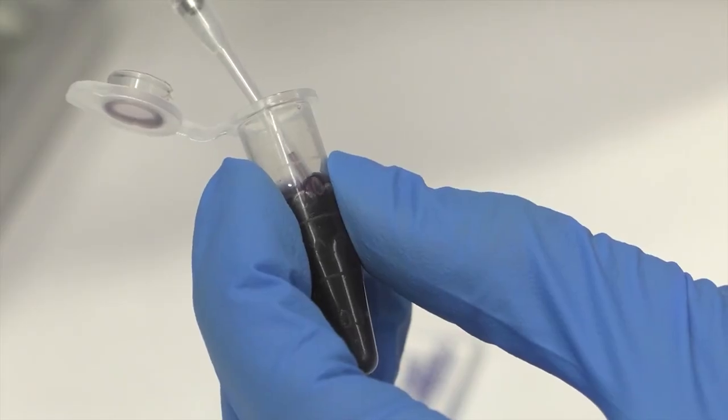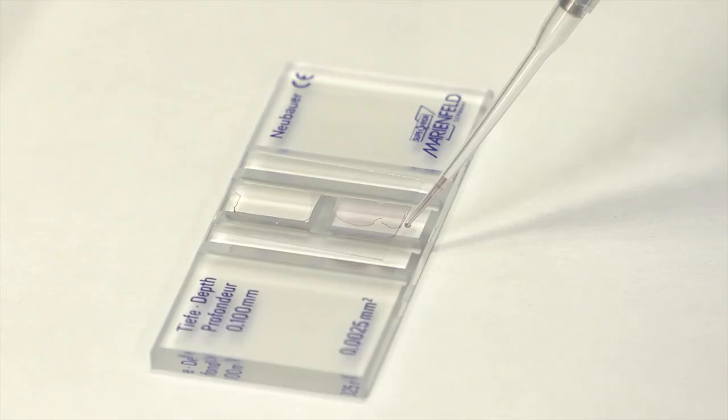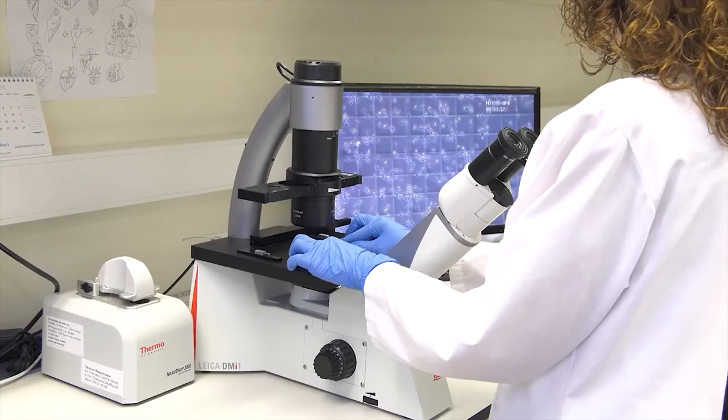Once the sample has been deposited in the central area of the chamber, the leukocyte count shall be carried out in the 4 lateral squares. For a good cell count, the 4 squares shall be counted in their totality following the same criteria as for the erythrocyte count and their mean shall be calculated.